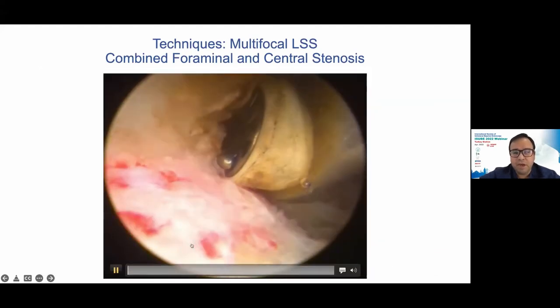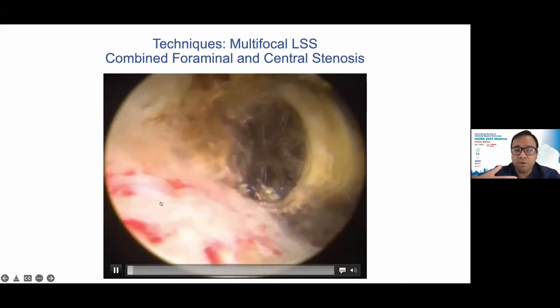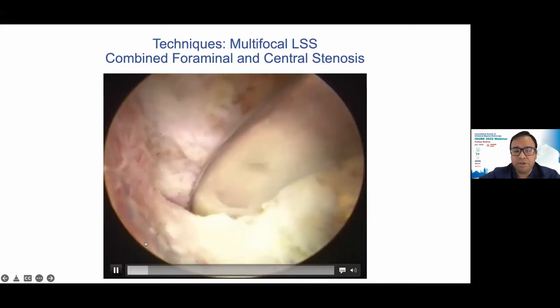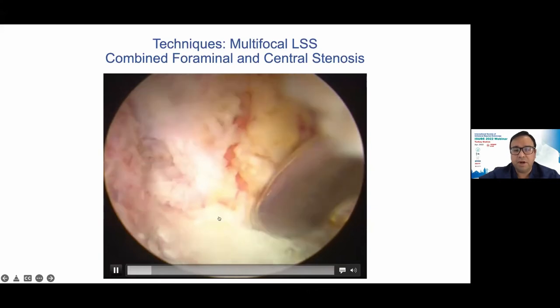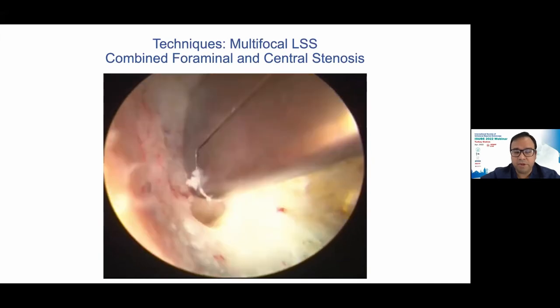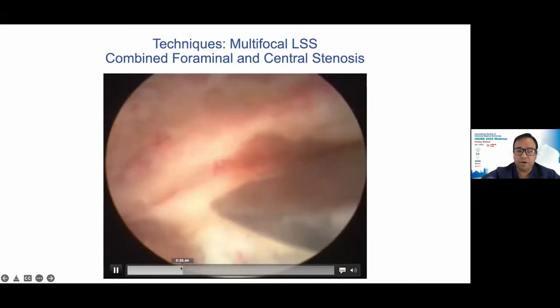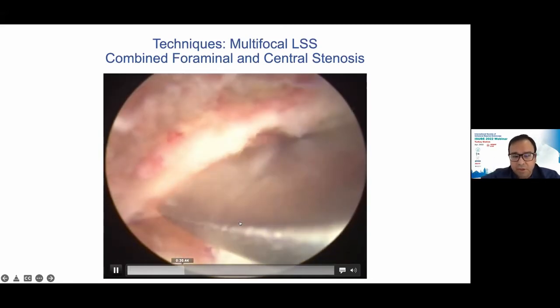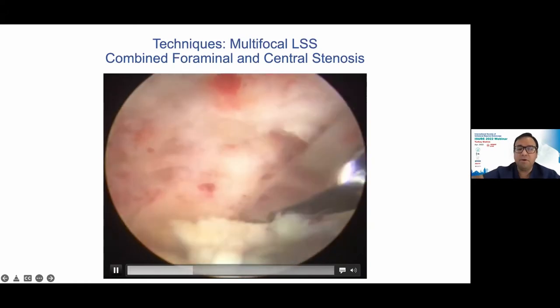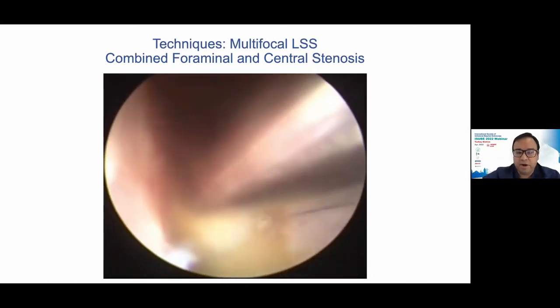You can see how we clean our surgical landmarks. Then we started with the bone decompression. We can see here how we detach the ligamentum flavum in the ipsilateral area to decompress the thecal sac. Then we cross the midline, and we can use Kerrison punches or common surgical instruments to go further to the foramen in the contralateral area.